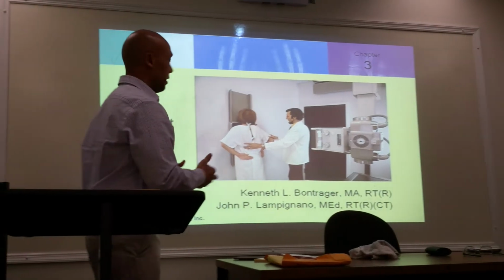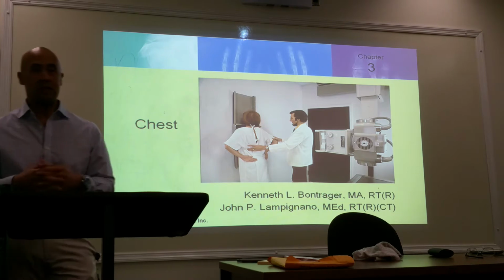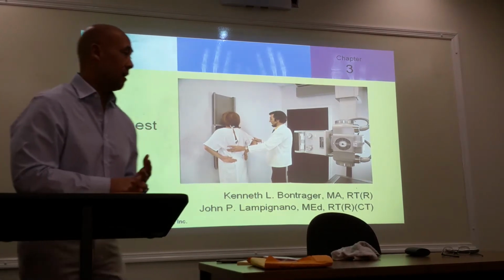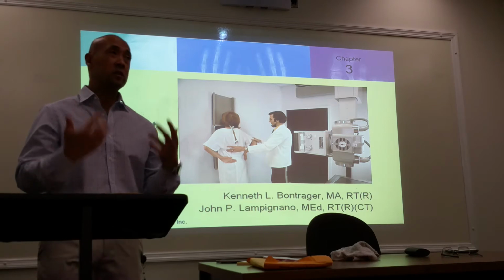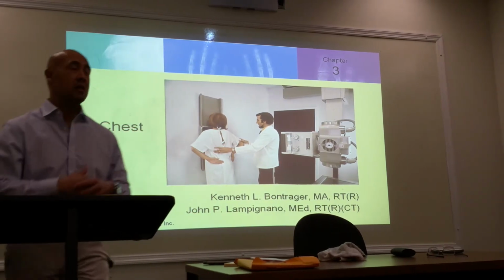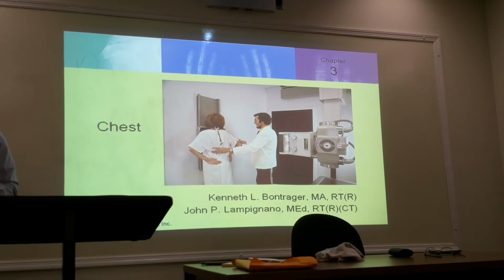That we'll be covering until the end of the semester are going to be the bulk of the exams that you will be doing in radiology. And I know you've heard the students saying over and over again that most of the procedures that they do are chest x-rays. Chest x-rays are done for everything. They're done as a routine, they're done as a preoperative mechanism. So when people go in to have surgery done, basic routine orders are for a chest x-ray, lab, and EKG. So chest x-rays are always part of some kind of routine. The abdomen is going to be the next that we'll be covering, and then also the ribs or thoracic cavity. So again, this is going to be a bulk of the procedures that we're going to be doing here.